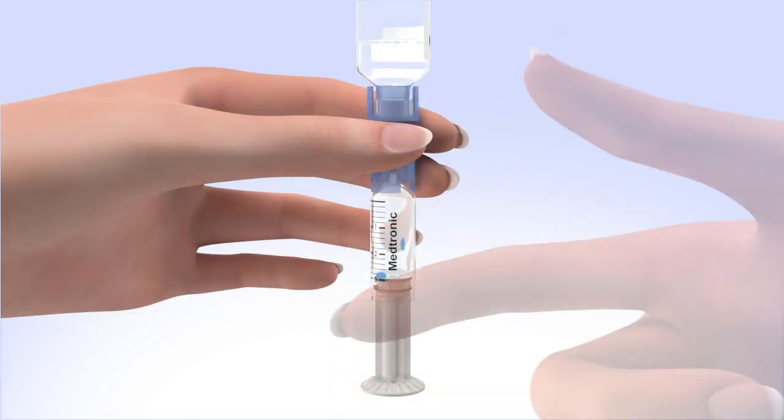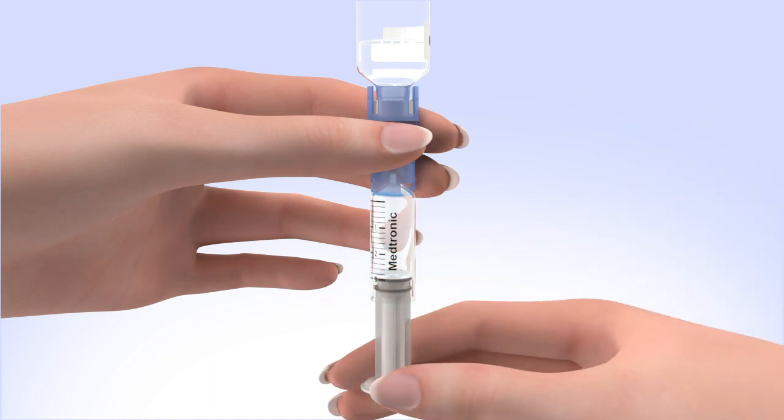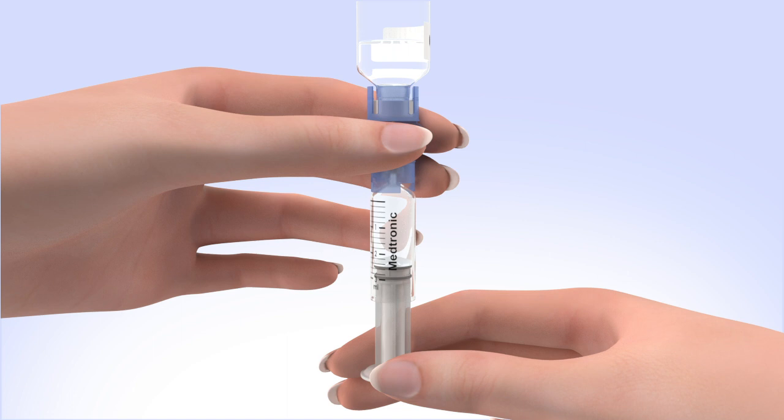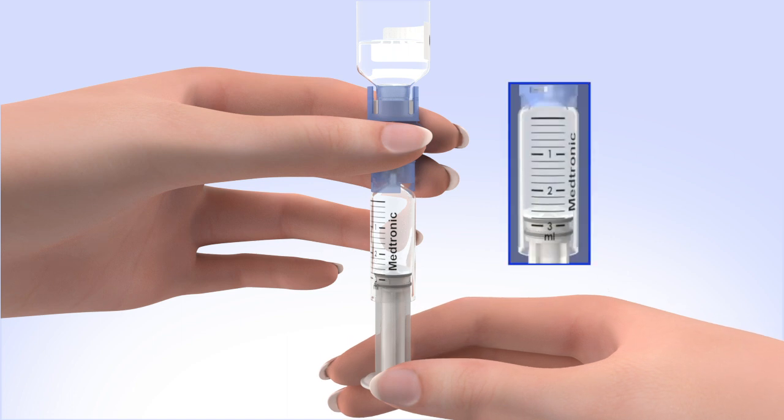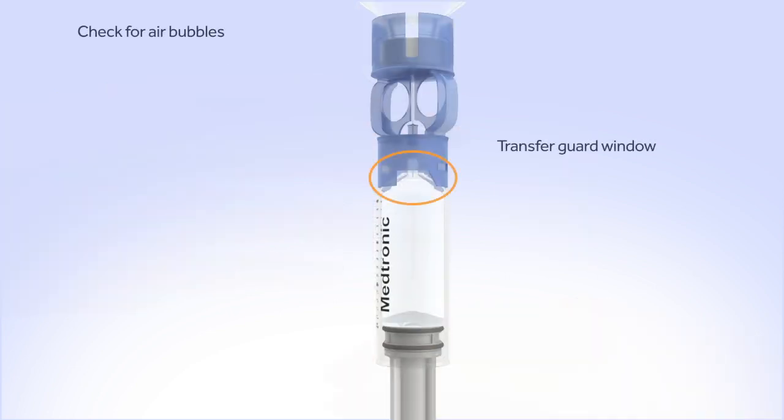Tap the reservoir hard enough to make the air bubbles rise to the top. Slowly push up on the plunger rod to move the air bubbles back into the insulin vial. Pull down on the plunger to fill the reservoir to the number of units desired. Repeat as needed until air bubbles are removed from the reservoir.